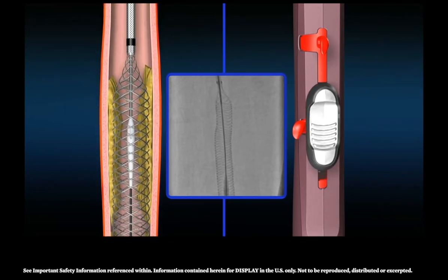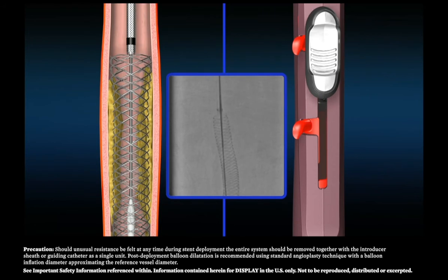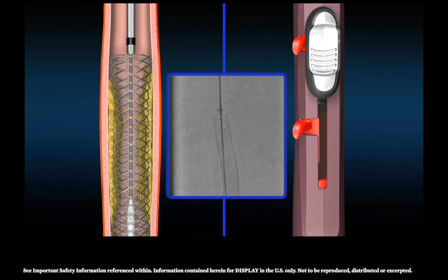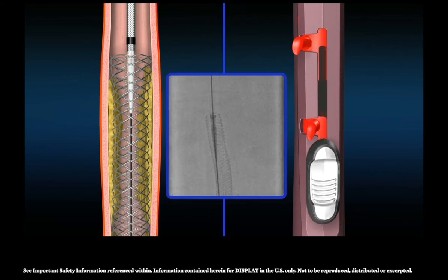To release the Supera implant, rotate the deployment lock to the unlocked position. Slowly advance the thumb slide to complete deployment. Following confirmed implantation of the Supera stent, retract the thumb slide in a single motion to the starting position on the handle and rotate the system lock and deployment lock into the locked position in line with the thumb slide.